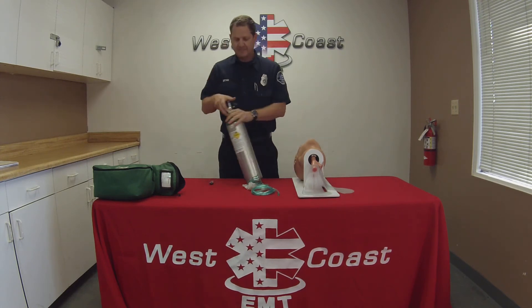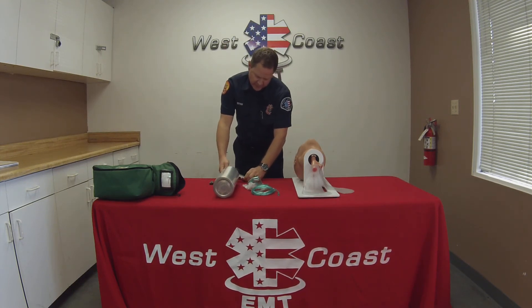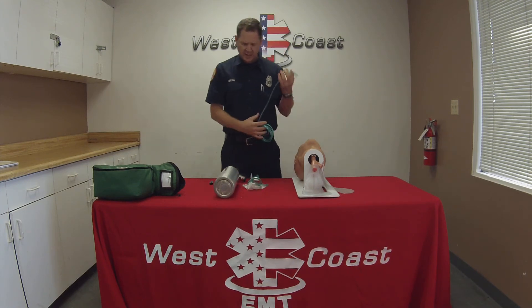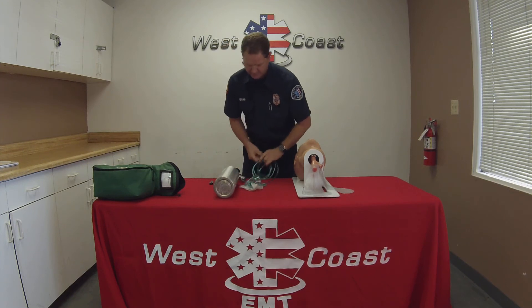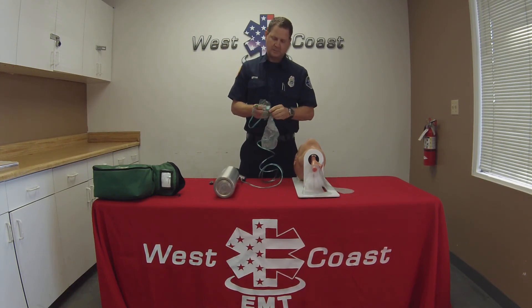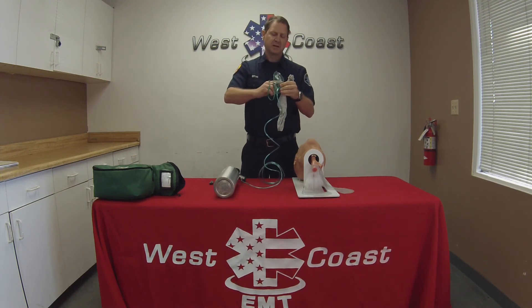I'll go ahead and place this down on its side and adjust it to 10 to 15 liters. I will attach my oxygen tubing, then attach it to the mask. I will fill up the reservoir bag by placing my finger over the stopper here, so this would inflate.